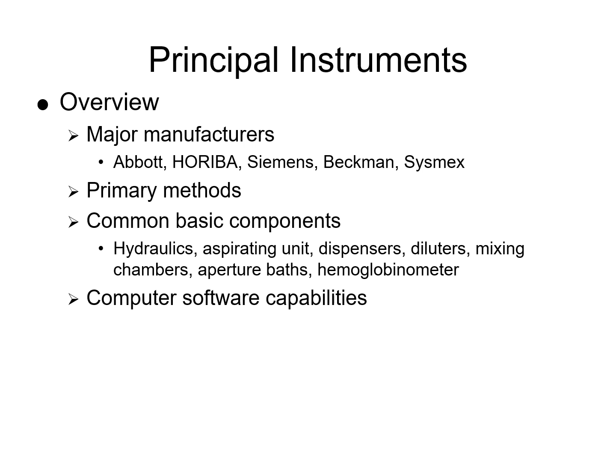We have computer software capabilities, where modern hematology analyzers are now equipped with sophisticated computer software that can help handle data acquisition and processing, result interpretation and flagging abnormal values, quality control management, and connectivity for laboratory information systems.